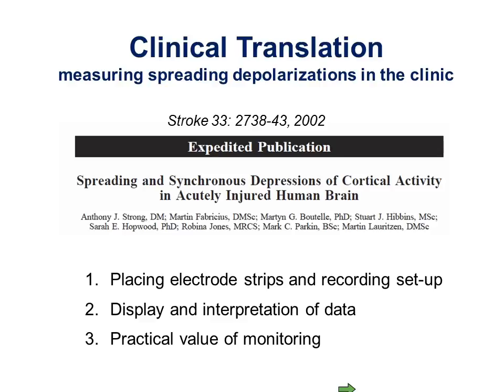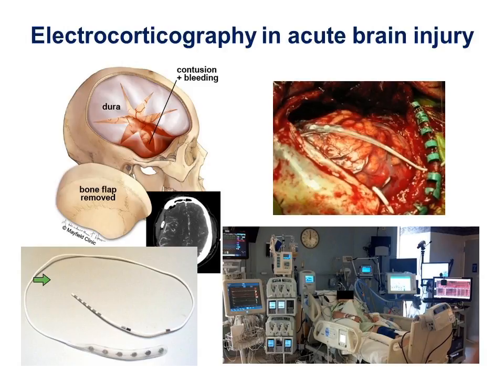And so beside the observation of the spreading depolarizations commonly in brain injured patients, Dr. Strong's really seminal contribution, I think, was providing the community with a method that could be widely adopted by neurosurgeons and neurointensivists, which is the use of these linear six-electrode subdural strips to monitor patients who require craniotomy for decompression or evacuation of hematomas, clipping of aneurysms, et cetera.